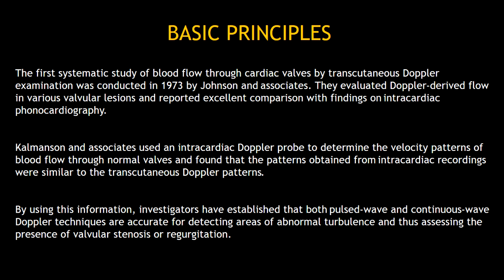They used an intracardiac Doppler probe to determine the velocity patterns of blood flow through normal valves and found that the patterns obtained from intracardiac recordings were similar to the transcutaneous Doppler patterns. By using this information, investigators have established that both pulse wave and continuous wave Doppler techniques are accurate for detecting areas of abnormal turbulence and assessing the presence of valvular stenosis or regurgitation.